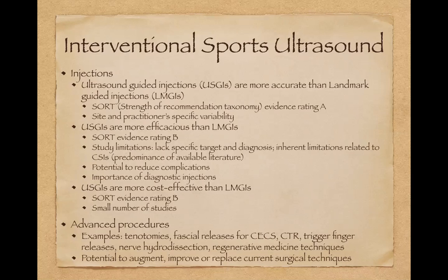You're spending that much money out of pocket, so you want to know exactly where you're putting the medicine. And then it says ultrasound also has the potential to augment, improve, or replace current surgical techniques, which we talked about for carpal tunnel release.